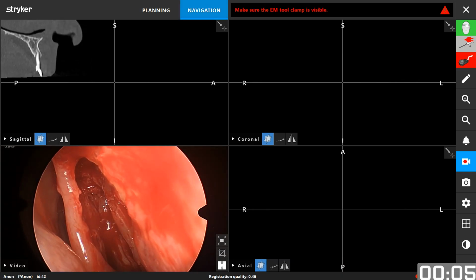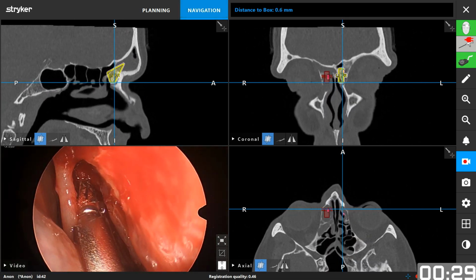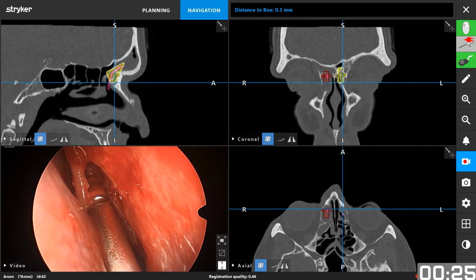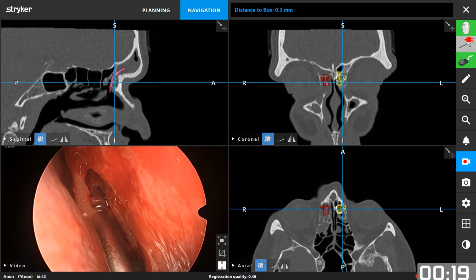And also we need to remove the frontal beak. In this case, not like the other case, we don't need it. Try to remove the bone with the through-cutting. Seems to not really work much. So the next step is using the drill.